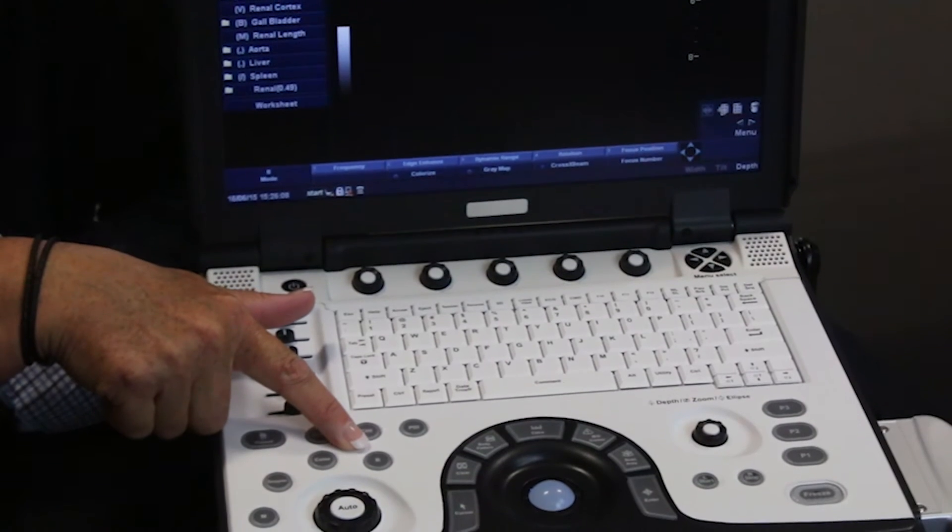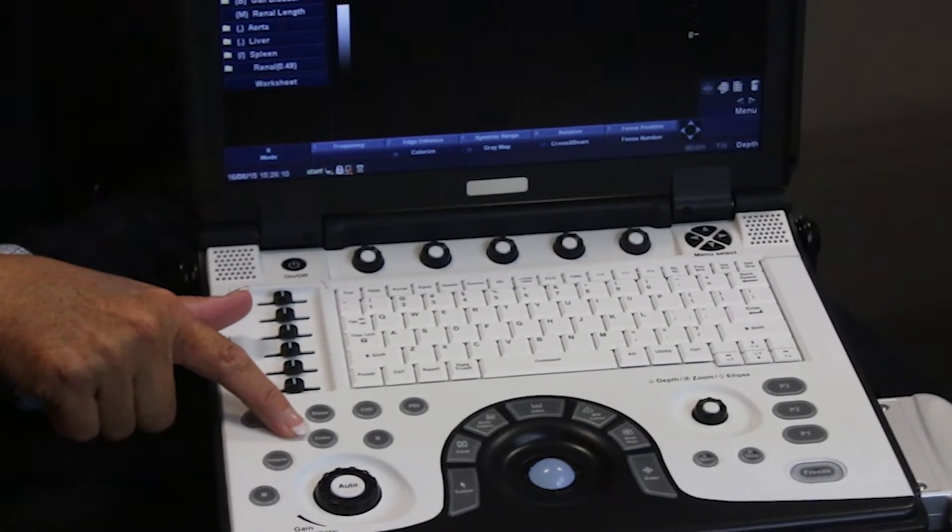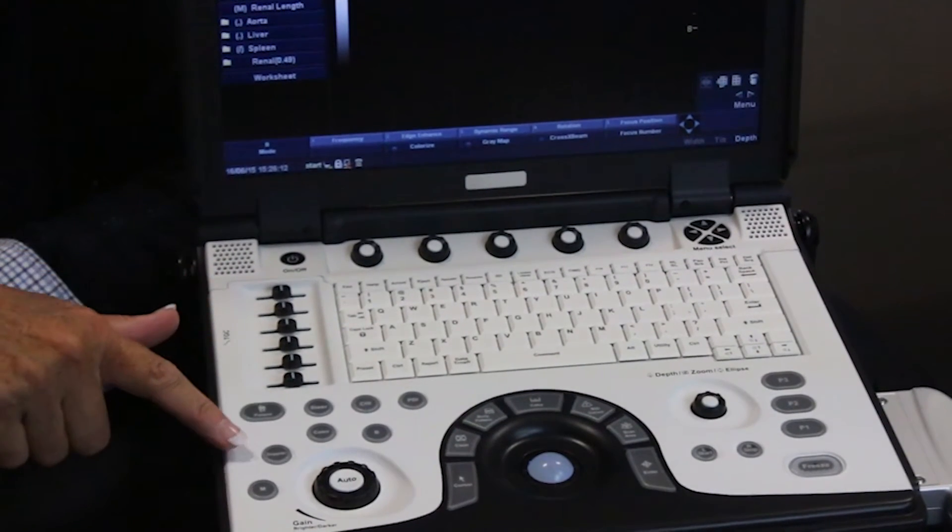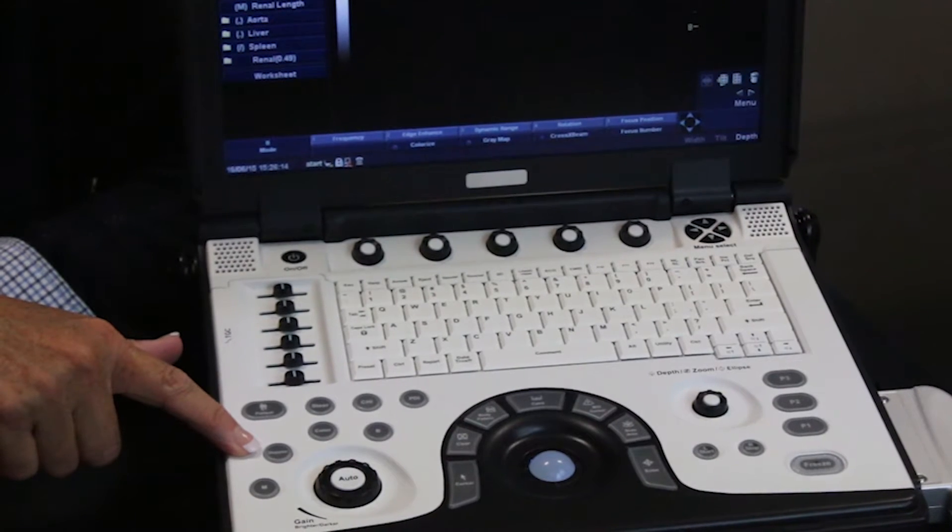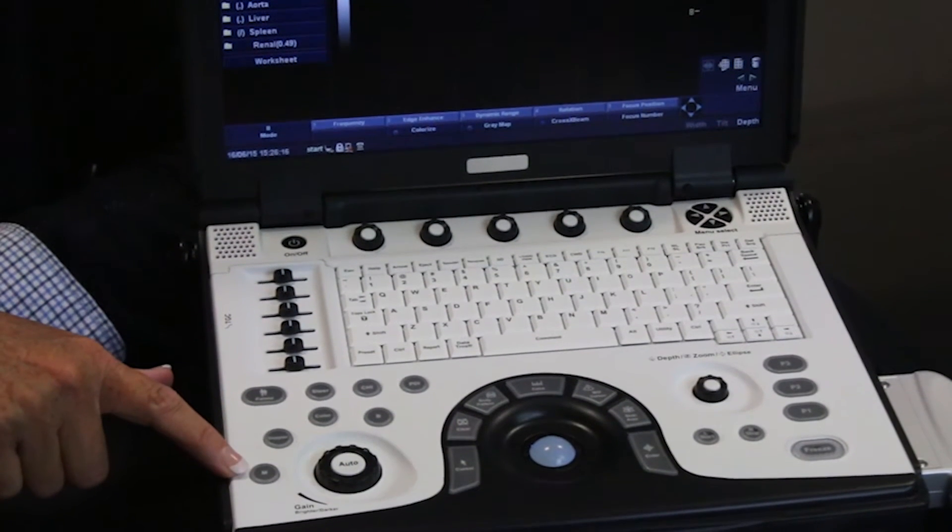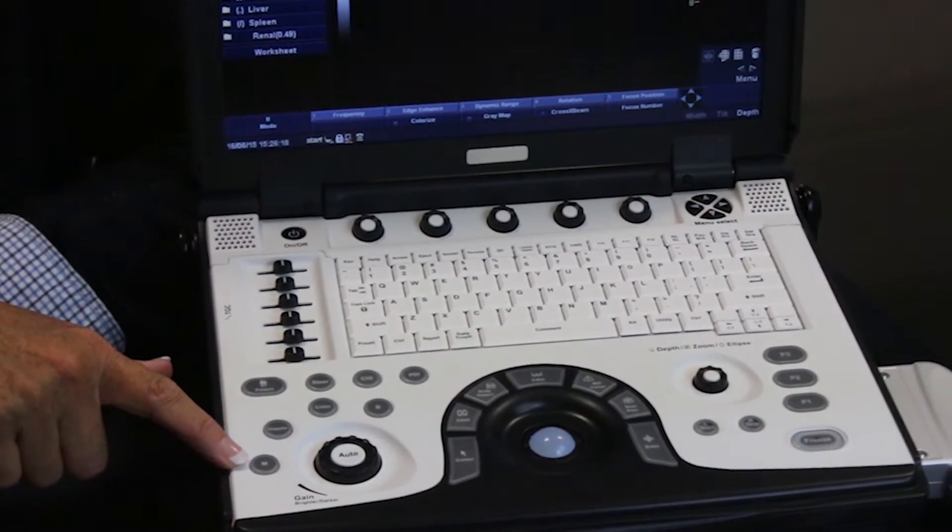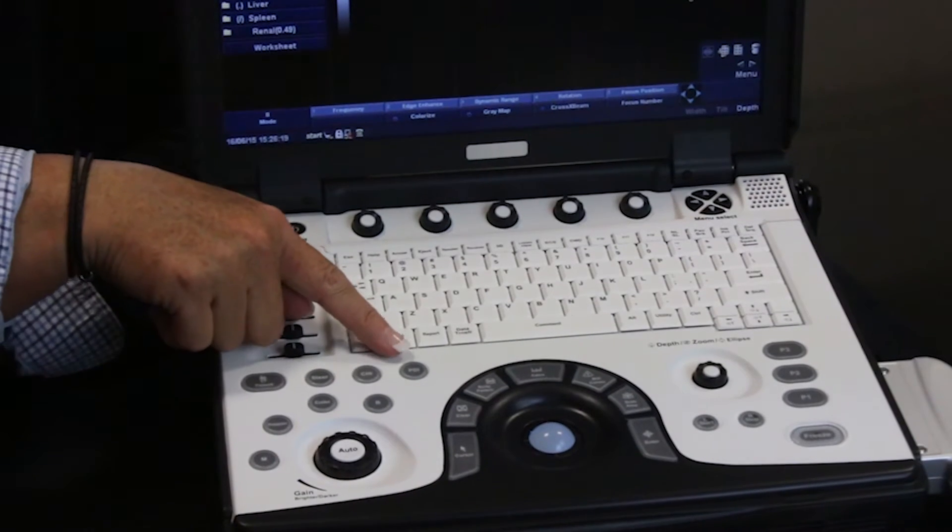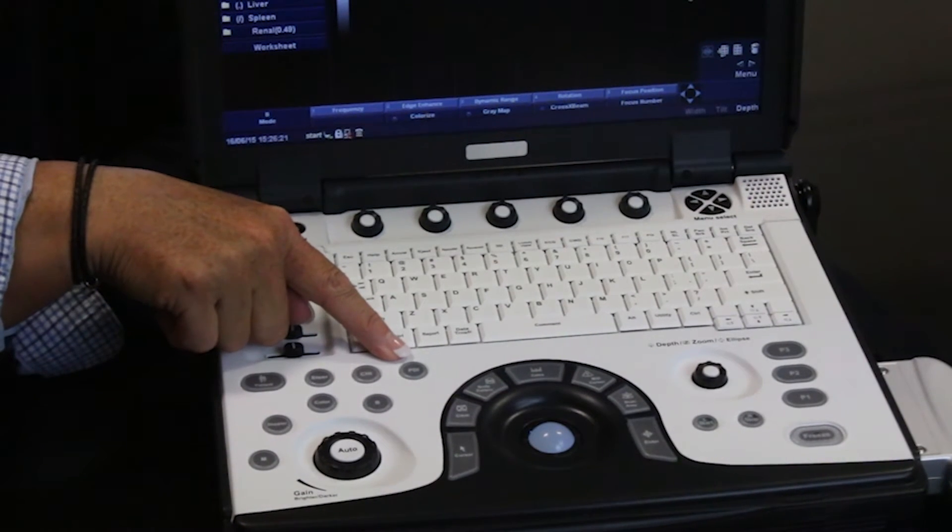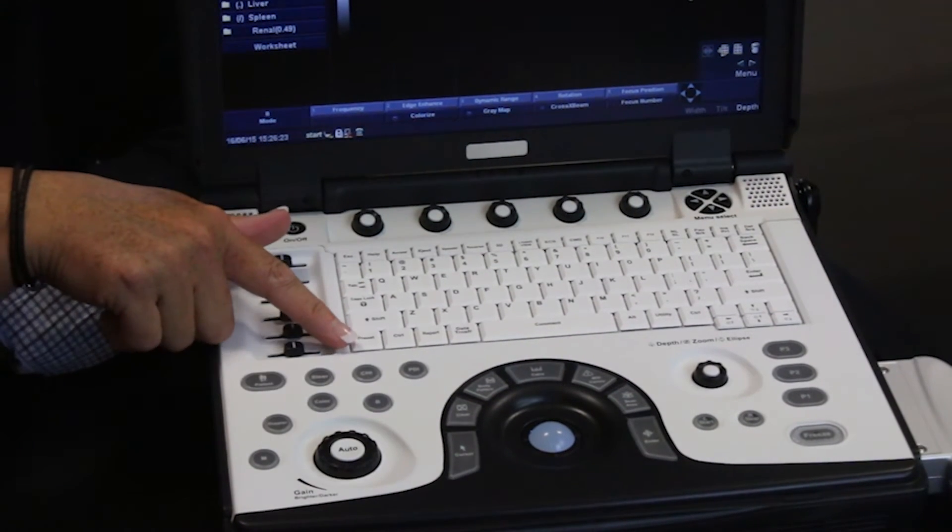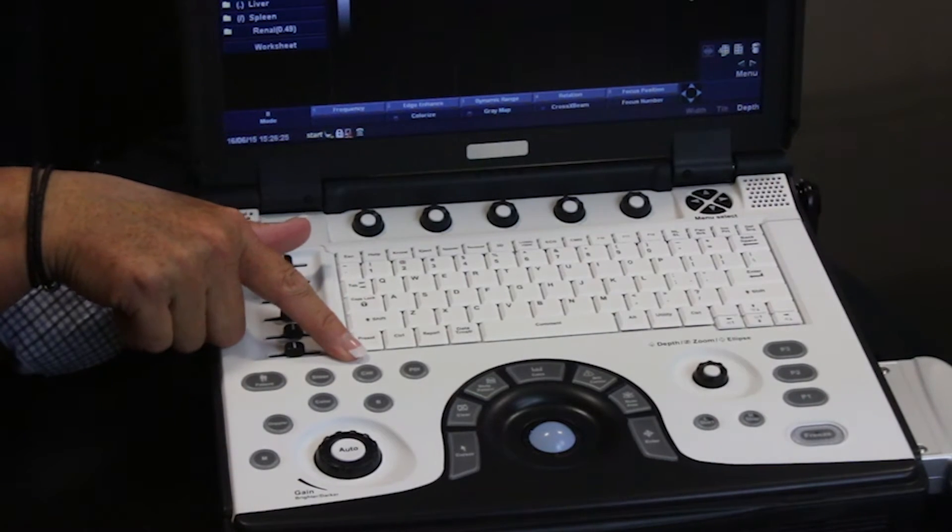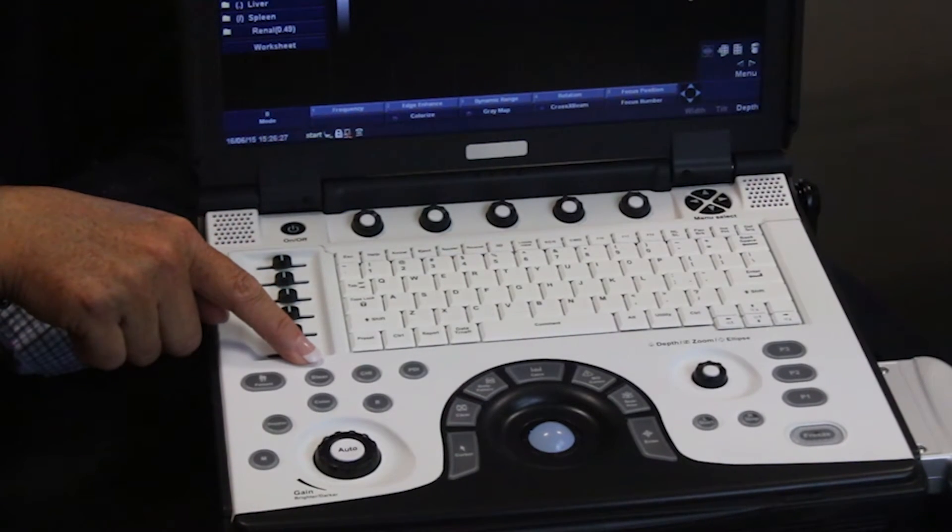We have B mode, colour Doppler, Doppler, M mode, power Doppler imaging or PDI, compound harmonic imaging and a steer function.